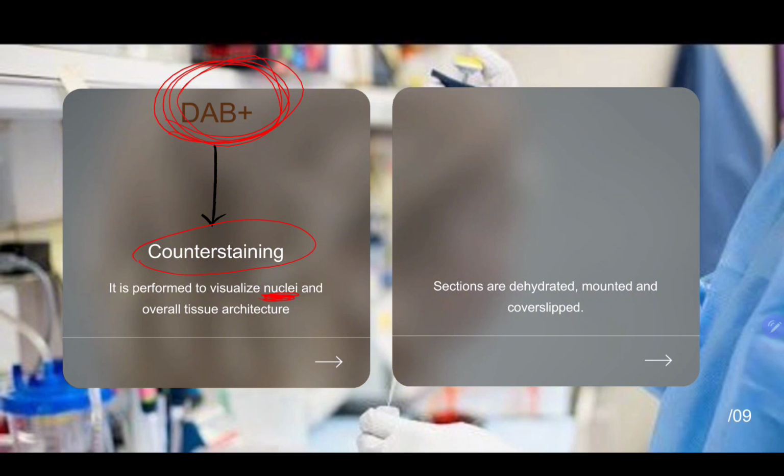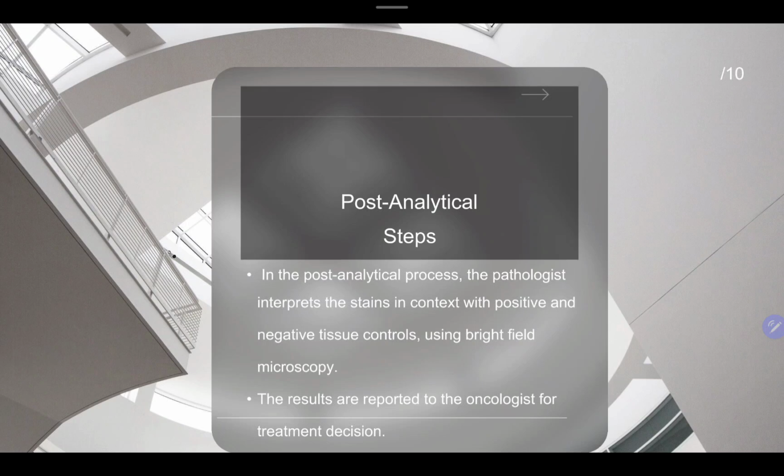After you perform ito silang procedure, the sections now are dehydrated, mounted, and cover slipped. Okay, dehydrated, mounted, and cover slip. Okay, so let's check for the post-analytical step. Isa-isa natin procedures later. So in post-analytical steps, the pathologist interprets the stains in context with positive and negative tissue control using the bright field microscope. The results are reported to the oncologist for the treatment decision.